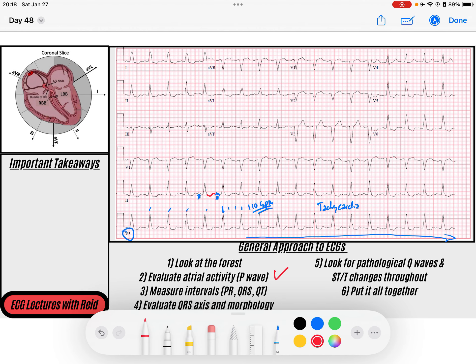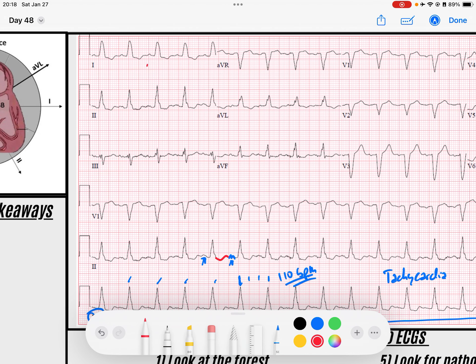We'll go to the next step: atrial activity. I noticed that I do have these P waves that are occurring before every QRS. These P waves are upright in lead I, and if I go to AVF, these P waves are upright in AVF as well. So we do have sinus P waves, and that helps me think maybe this is a sinus tachycardia.